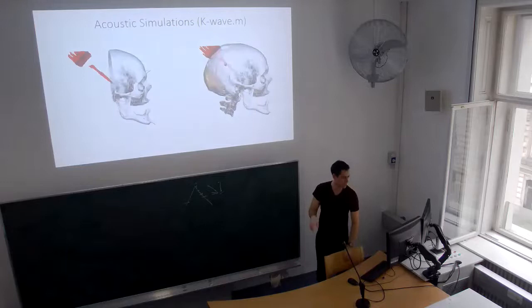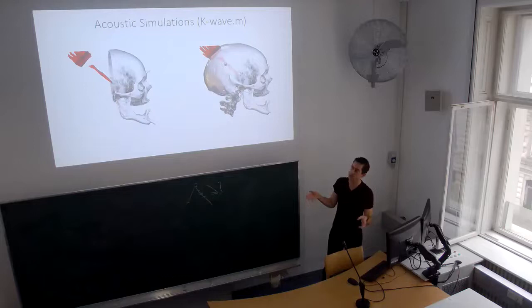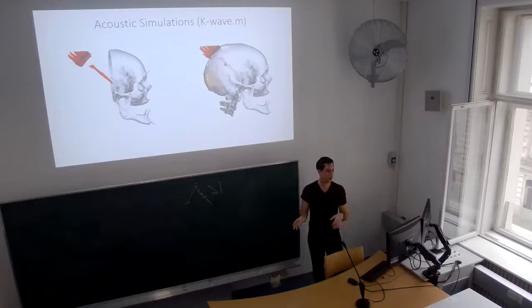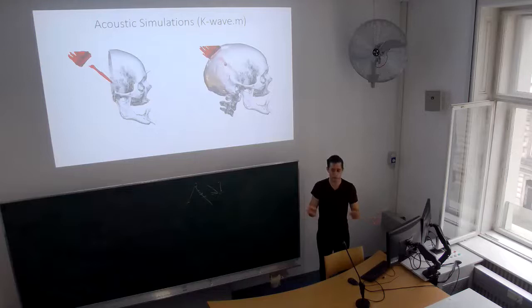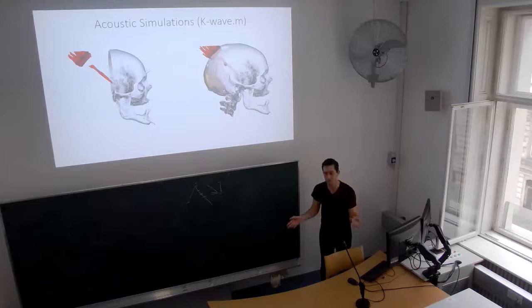Okay. So because of all of this complexity, what you really want to do is run an acoustic simulation through a skull model. If you have thought a lot about your design, like where you want to enter through the skull and what you want to hit, often what people who are big into doing this will run a simulation like this. They'll take a really high resolution CT skull, and then you can use this MATLAB program that is used for general simulating sound wave propagation. That's ideally what you would want to do to confirm the exact focal properties that you have, that it's not attenuated too much, that there's enough energy getting in the head, and that it's not made too inaccurate by bouncing off the skull or being absorbed by the skull.